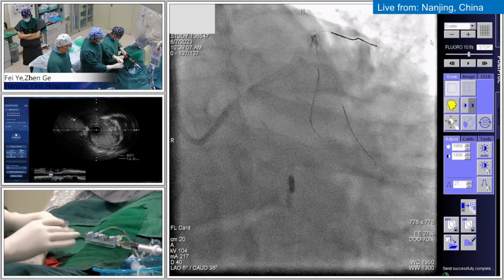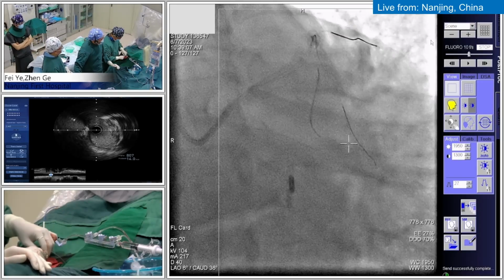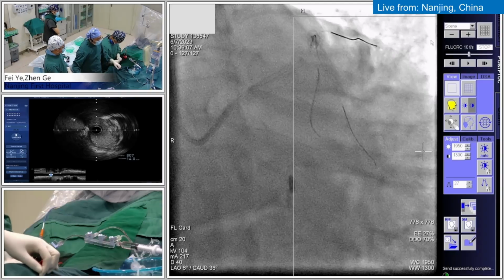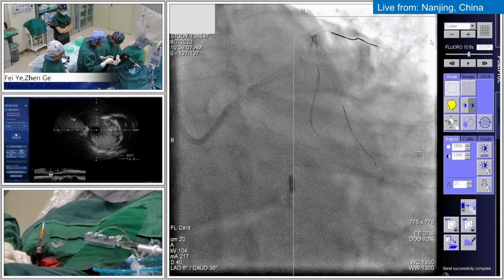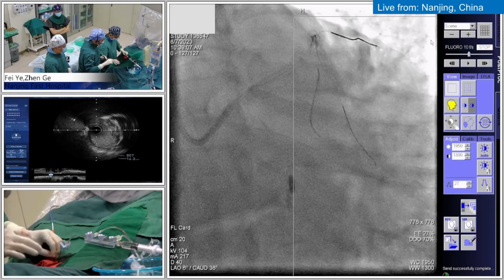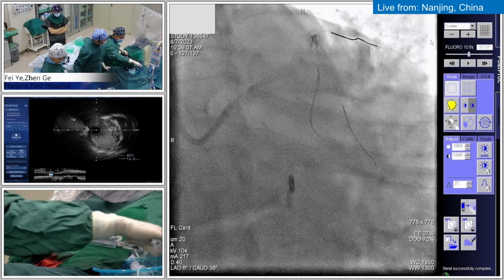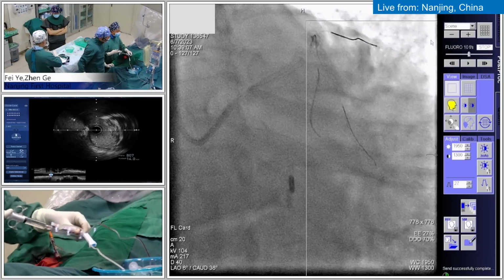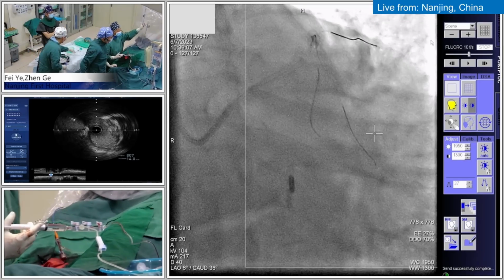So before you do post dilation in the stent, will you leave the wire there, jailed under the stent, or change the wire after protection, or just pull the wire back to perform the post dilation? That is a great question for this bifurcation.